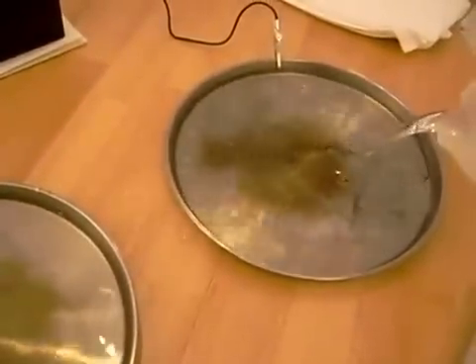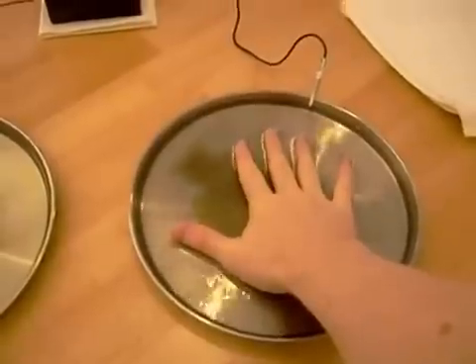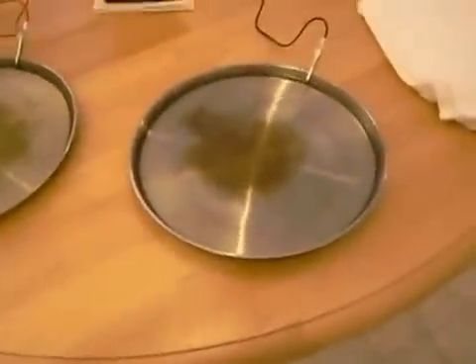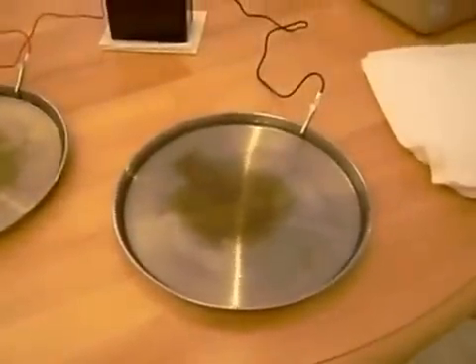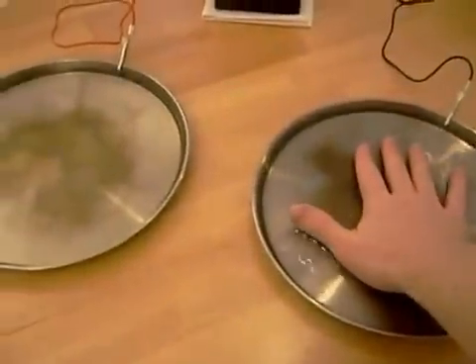Fill them up. Now at this point, the only thing you have to do is place one hand in this pan and one hand in this pan. Usually it's best to make sure the water is about lukewarm — not hot, not cold, somewhere around lukewarm. And when you place both of your hands in, you will complete the connection.